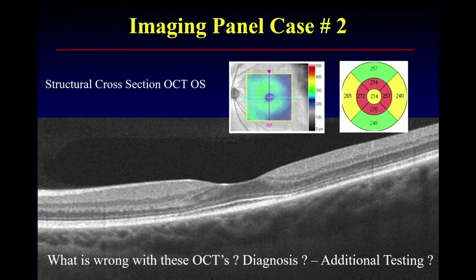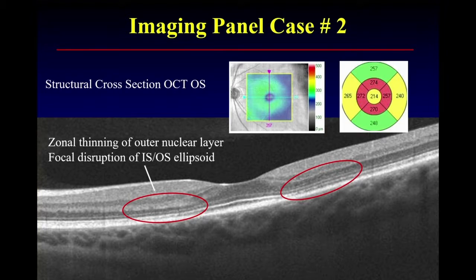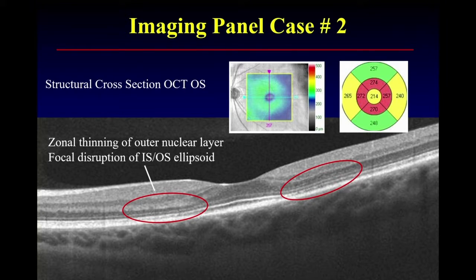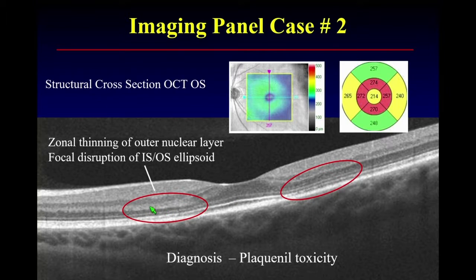Is this pathognomonic for any diagnosis? What else would you like to see? I would like fundus autofluorescence and OCT angiography. The characteristics of this zonal thinning of the outer nuclear layer are there, and I think you can also see that on the maps. This off-axis image shows Henle's fiber layer very clearly — that's the hyperreflectivity being referred to. It does demonstrate that the outer nuclear layer is thinner there, and those areas of ellipsoid zone loss are visible. Due to the tilt, you can see Henle's layer.